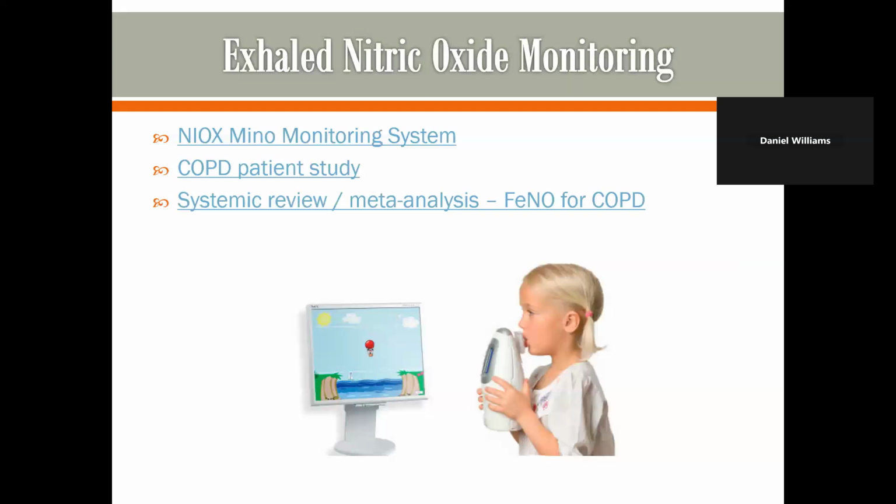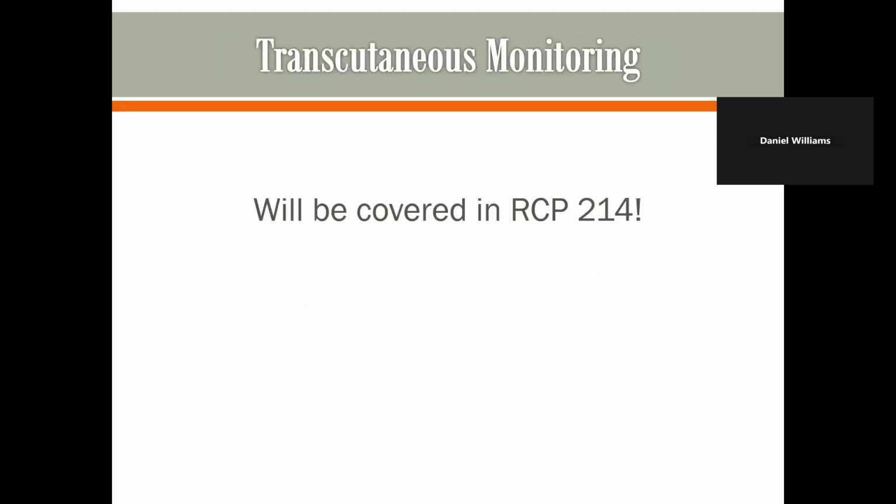Exhaled nitric oxide monitoring, we talked about that, the role it has with asthmatic patients, which, not that children are the only ones that have asthma, but that's why you see the pediatric patient in the photo there. So if you're looking at the exhaled nitric oxide, we would utilize that for your asthmatic patients and COPD patients as well.